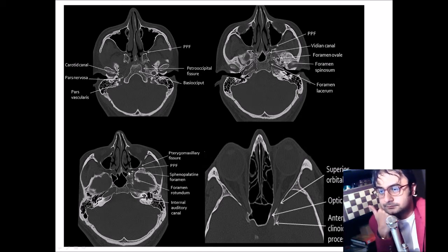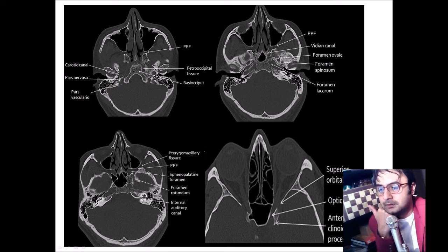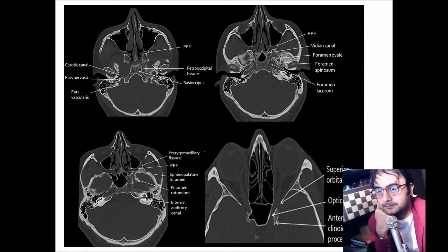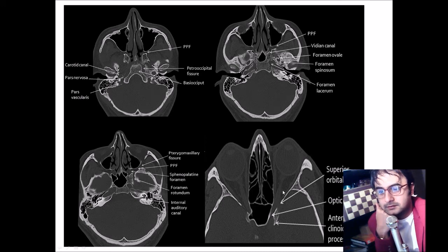On an inferior slide very near to the base of the skull: here is the internal auditory canal seen on the left side, and here is the foramen rotundum, which is best seen in the coronal views. You can again appreciate the foramen spinosum (small one), the foramen ovale (larger one), and the longer one is the foramen lacerum. In the last slide you can see the optic canal running through at the level of the superior orbital fissure, and these are the anterior clinoid processes.